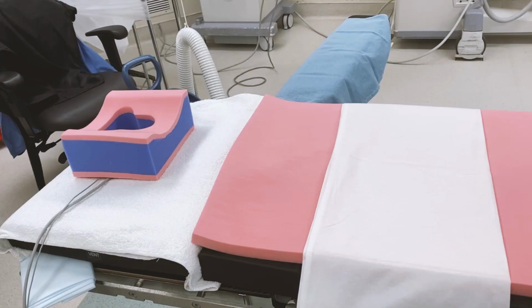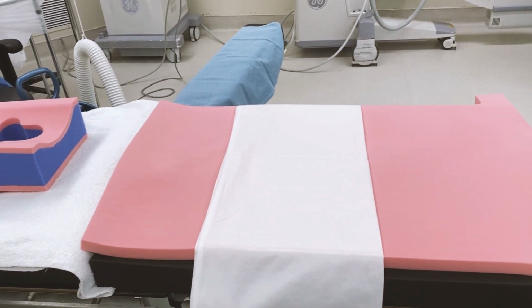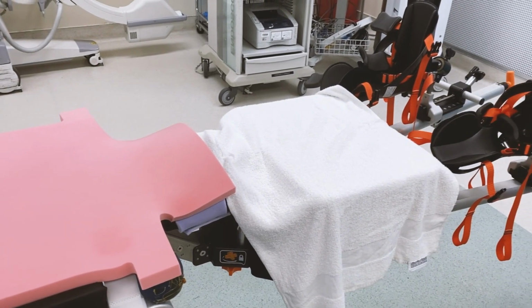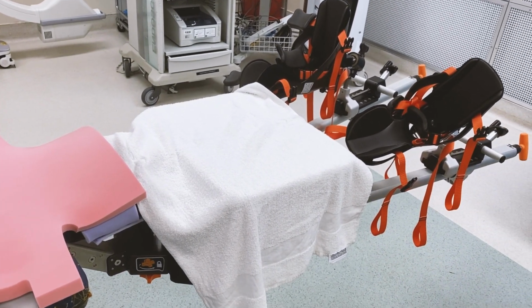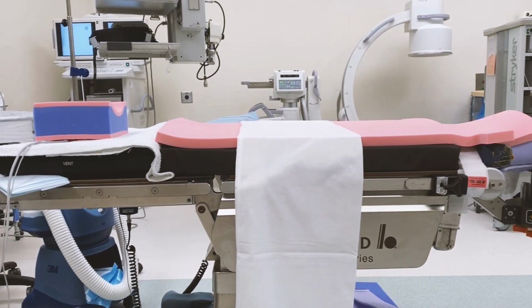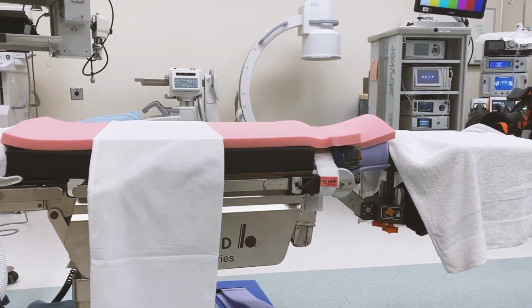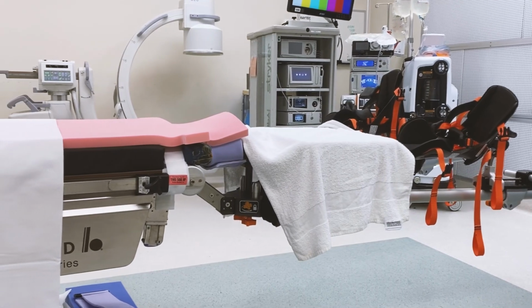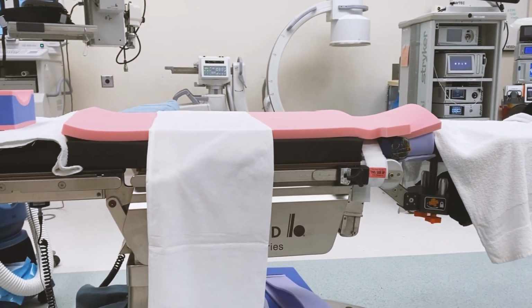Some of the technology that I'm utilizing today, which is cutting edge, in surgery include using postless distraction. This is a relatively new concept in which we're able to utilize a foam pad on the bed and avoid having to use a perineal post, which has a known complication of numbness in the groin after surgery and even erectile dysfunction. We've been able to eliminate the post by using postless distraction or the pink hip kit, which we now use on every single patient in the operating room. This has been able to decrease the amount of pain the patient has, as well as improve the recovery and decrease complications.